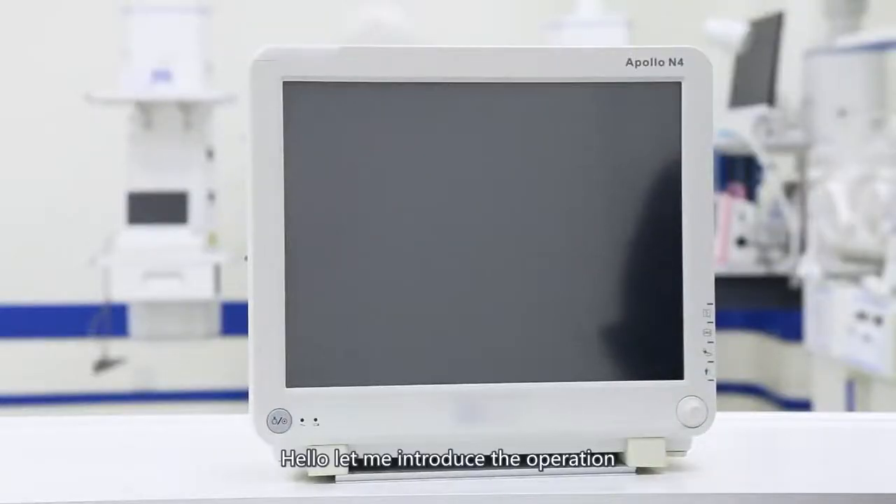Hello, let me introduce the operational instruction of Patient Monitor N4.